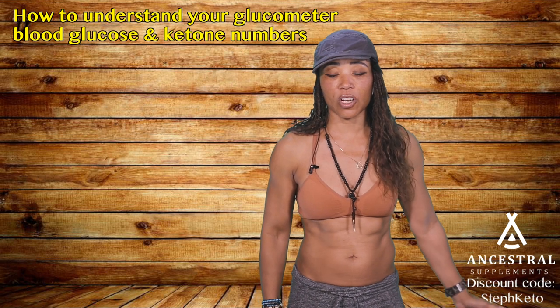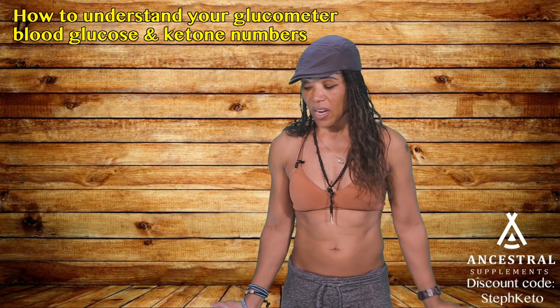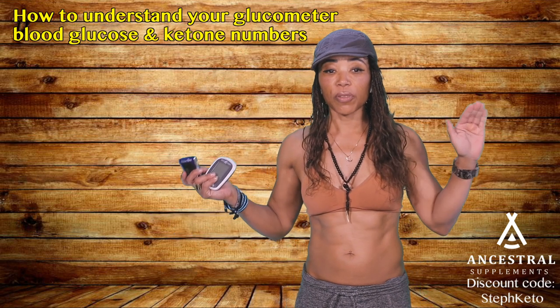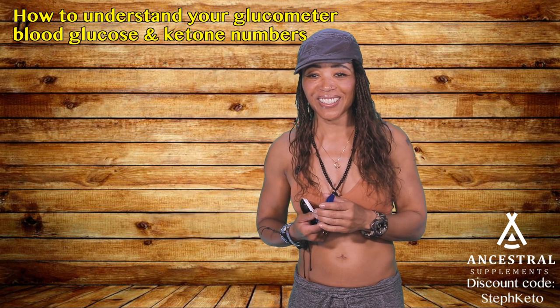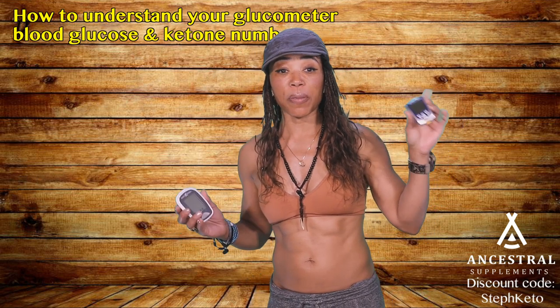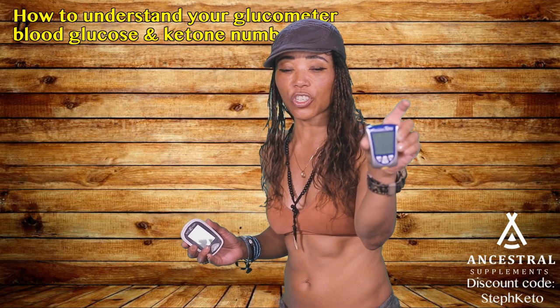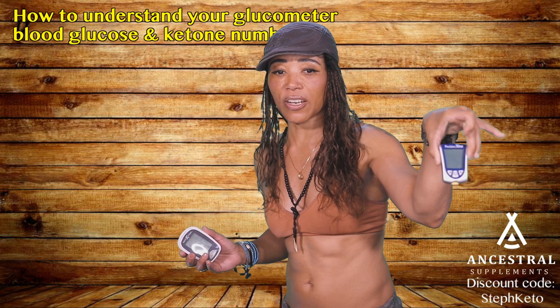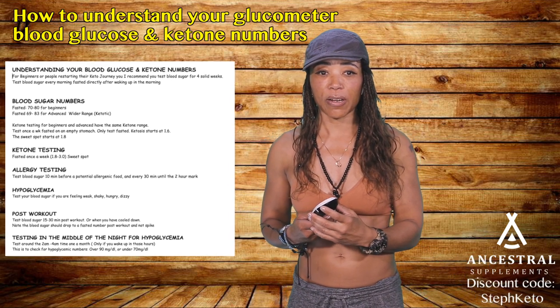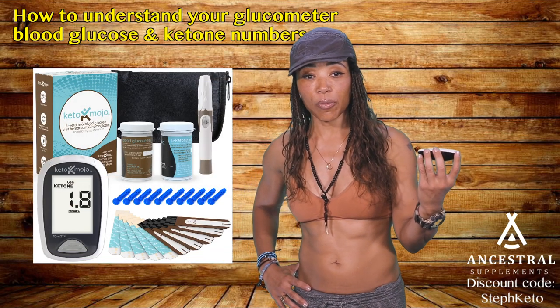Let's talk about the glucometer. There are different kinds. I have two different kinds here. One is called Precision Extra — it's made by Abbott, the parent company that also makes Freestyle. It's a dual glucometer that measures both ketones and glucose. This one is smaller.